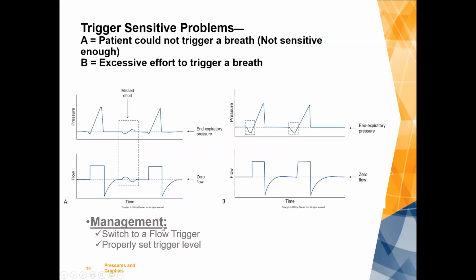So, some trigger sensitivity problems. The patient could not trigger a breath. The example in A is, you're seeing this middle dotted line, the missed effort, where the patient was actually sucking.